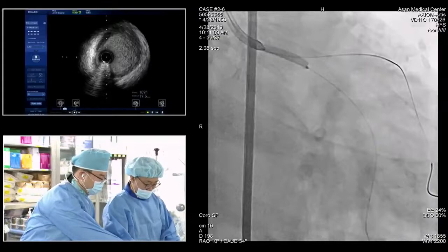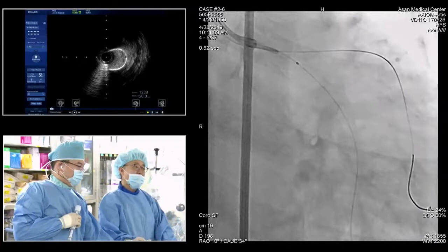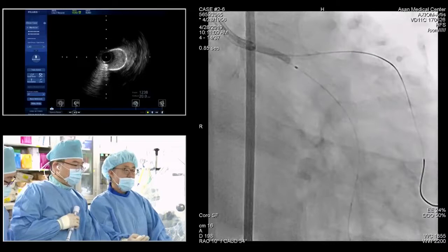Okay, I think the culotte suggestion is a very nice suggestion, and crush. The three most commonly used two-stent techniques are culotte, TAP, and crush. Our center usually prefers the crush technique, as we have much experience with it. We sometimes do culotte and TAP techniques.